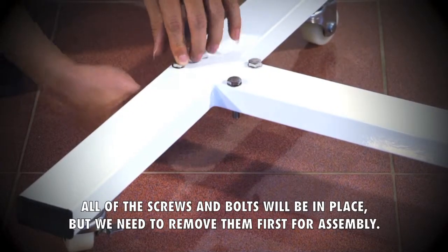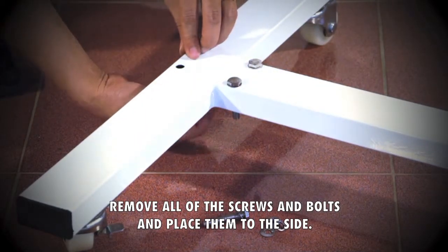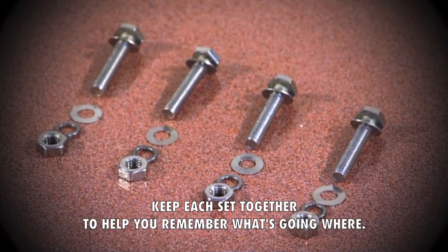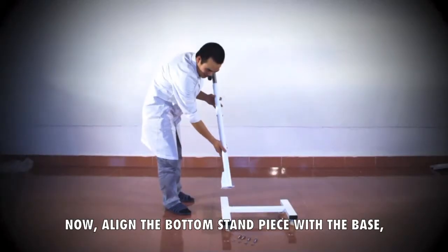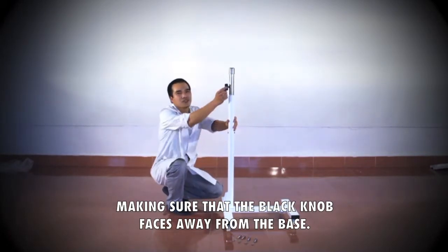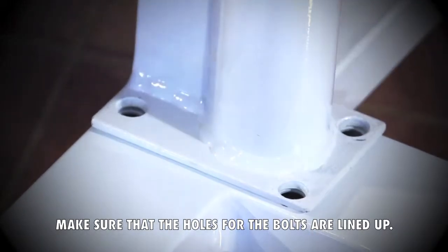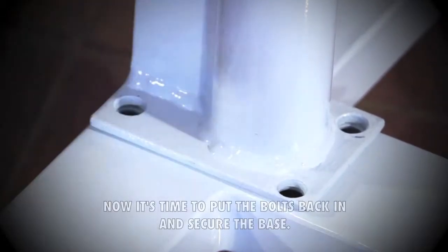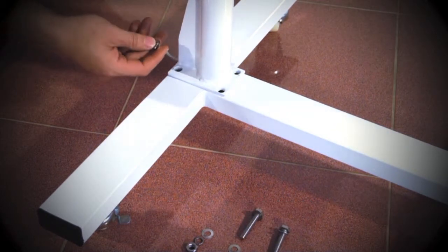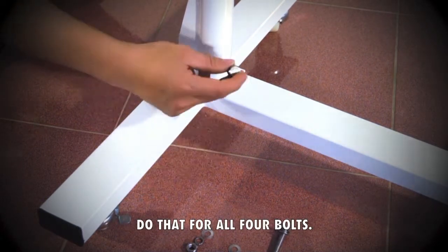All of the screws and bolts will be in place but we need to remove them first for assembly. Remove all the screws and bolts and place them to the side. Keep each set together to help you remember what's going where. Now align the bottom stand piece with the base, making sure that the black knob faces away from the base. Make sure the holes for the bolts are lined up. Now put the bolts back in and secure the base. Put the thin washer on the bolt and place it in the hole. Do that for all four bolts.